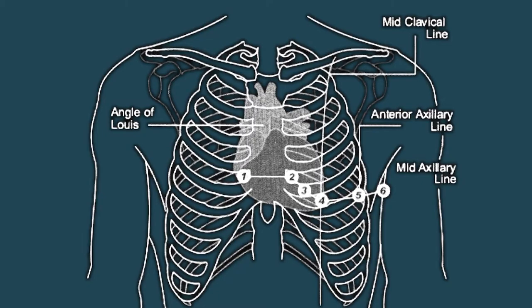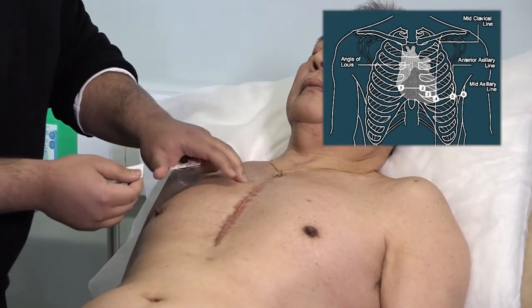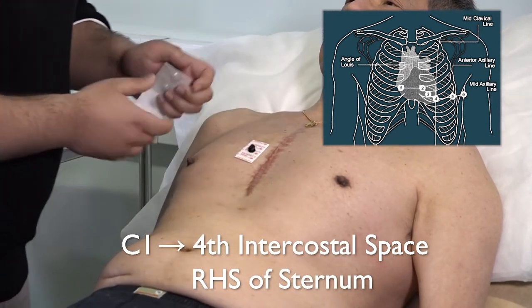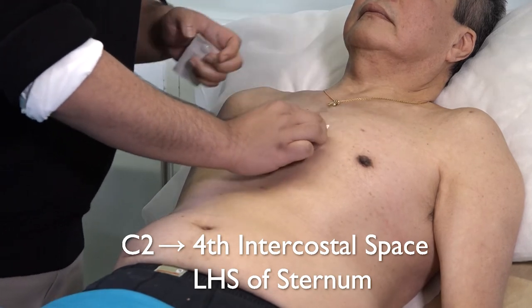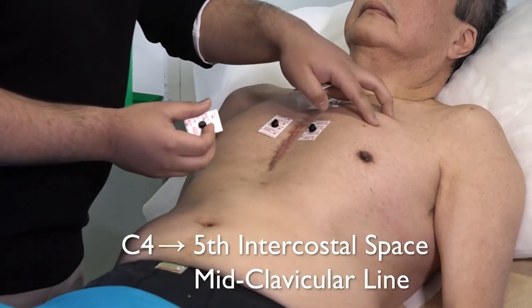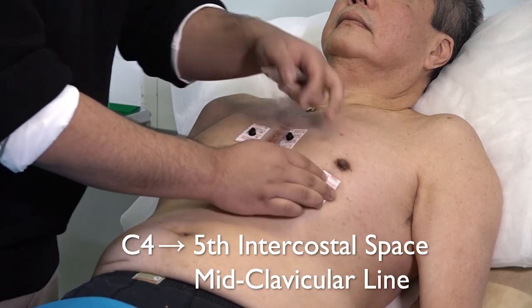Place the six chest electrodes in the following positions. Chest one: fourth intercostal space, to the right-hand side of the sternum. Chest two: the fourth intercostal space, to the left-hand side of the sternum. Chest four: the fifth intercostal space, mid-clavicular line.